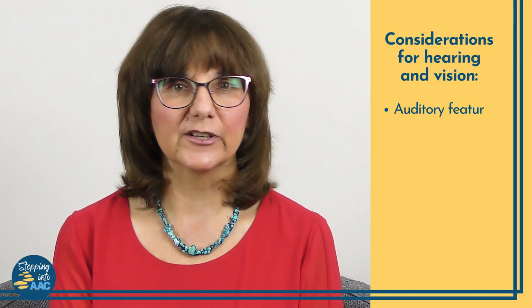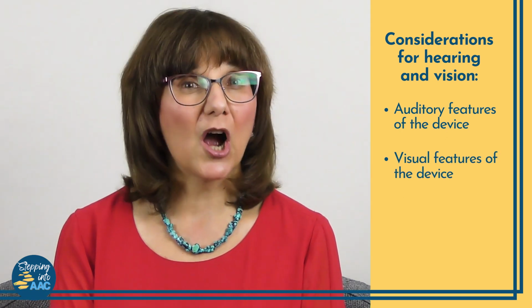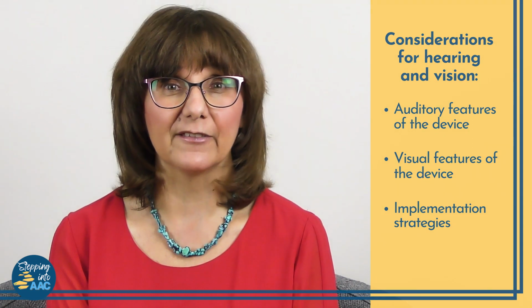Adjustments to auditory and visual features seem a reasonable first step, but it's important to also consider implementation strategies that teach AAC learners about other pathways that will help them navigate their device. As modifications are considered, we try to preserve access to the words they will need for ongoing language development. Part 1 of this 2-video topic will focus on settings and features of AAC devices. The second segment will explore those implementation strategies.